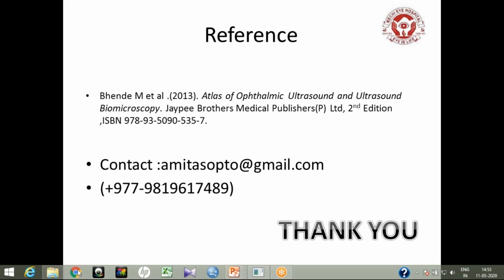When you want to do the 30-degree B scan, first you perform the axial scan. After that, you tell the patient to look towards the probe side. When the patient looks at the probe, the eye automatically turns.